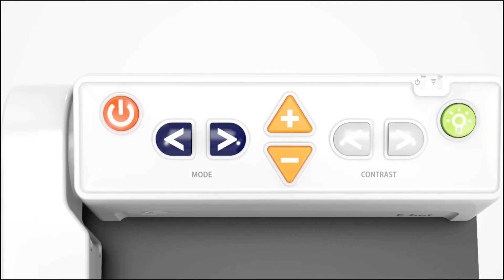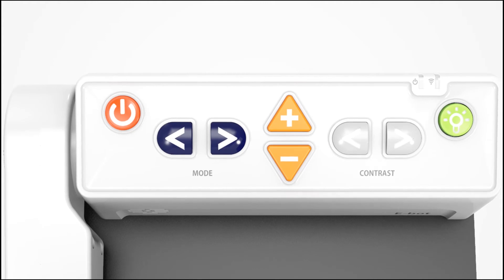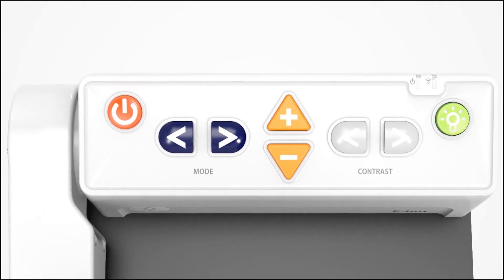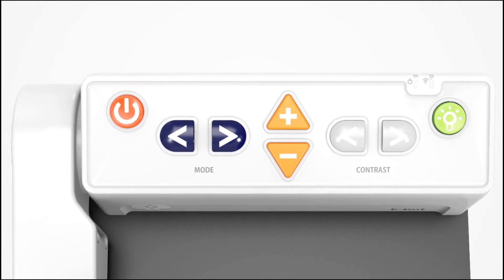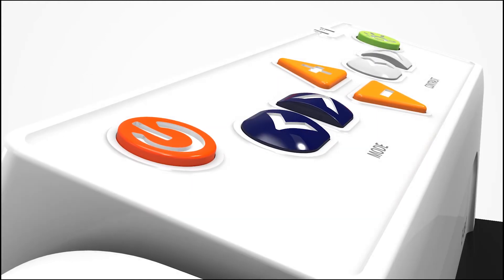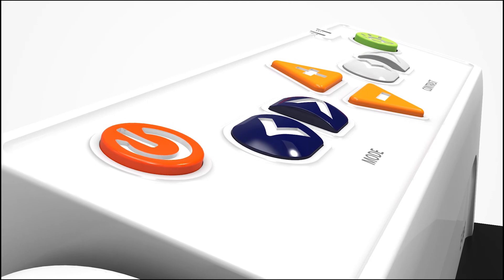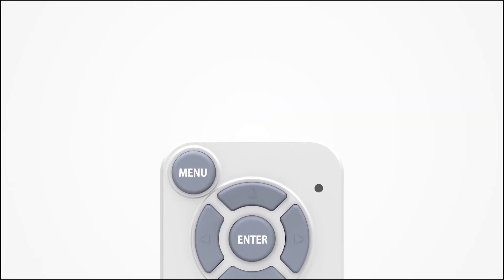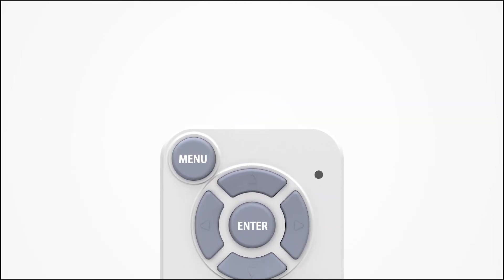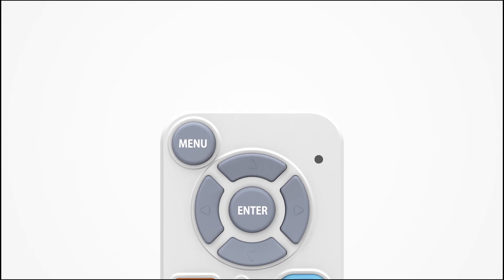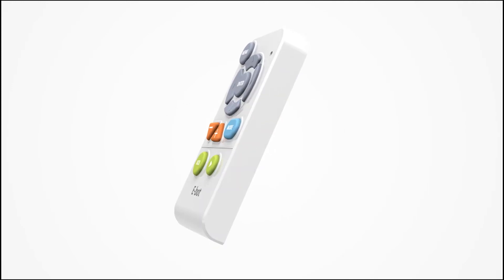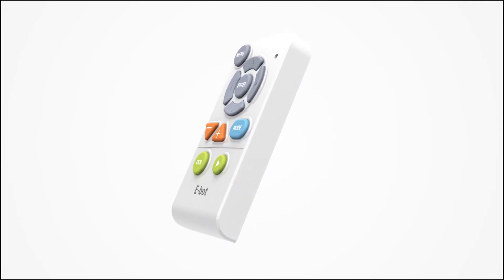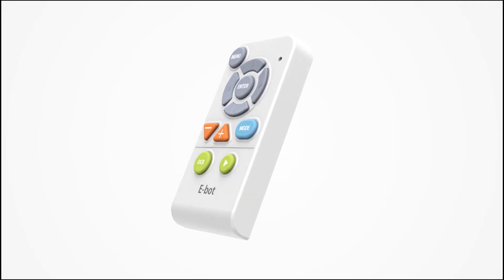The control buttons on the eBot Advance are so simple that you can understand its functions at a glance. The included wireless controller can also control all the functions of the device, making it easy to operate with one hand.